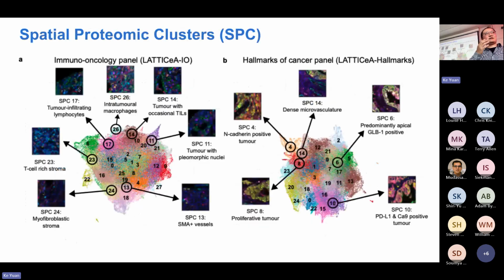So encouraged about this, we start to look at what the clusters are that these representations enable you to find. The interpretation of this is, I have to say, much harder than H&E, because even our pathologists can't really look at those images and say what they are. So this is where the cell segmentation could actually be helpful. You know, what are the enrichments of different cell types?